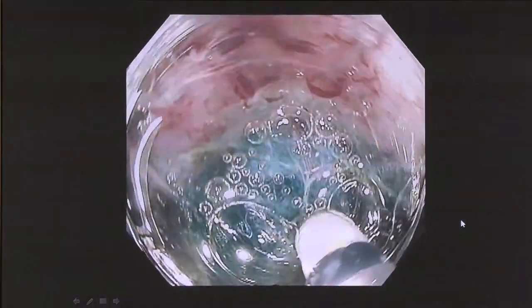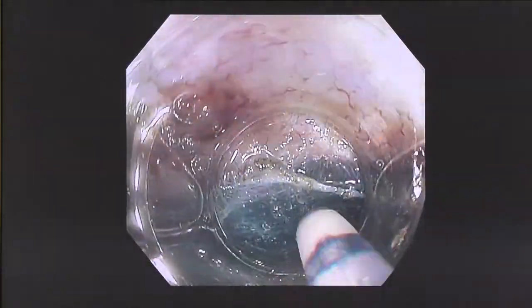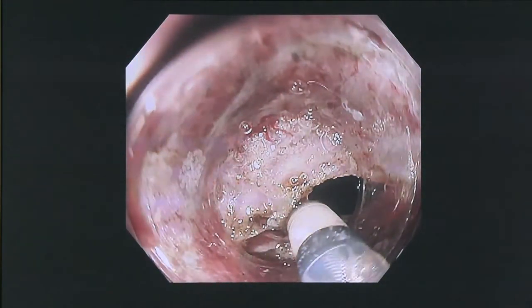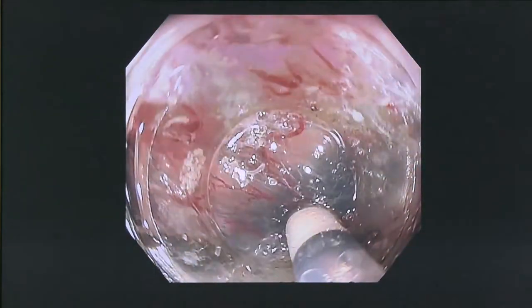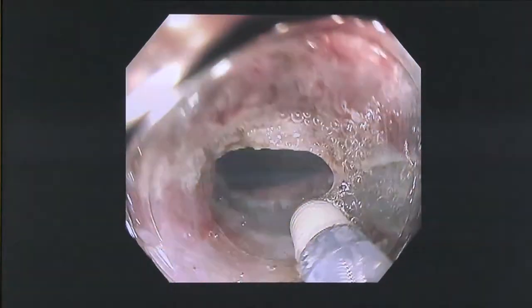I'll show you the video. So now, creating a pocket in the submucosal layer. And some vessels are coagulated. And now the tunnel is completed. You can see the proximal side. After this, you will widen the tunnel at both sides, like this. At the left side and now at the right side, I was widening the tunnel. Then at the end, I cut both sides.